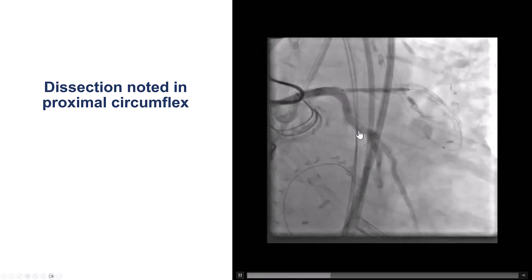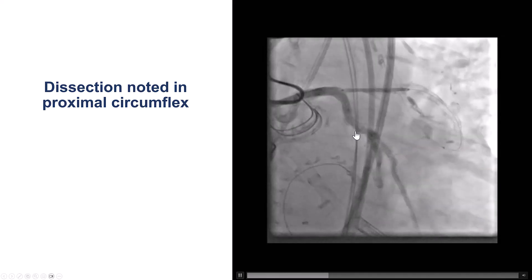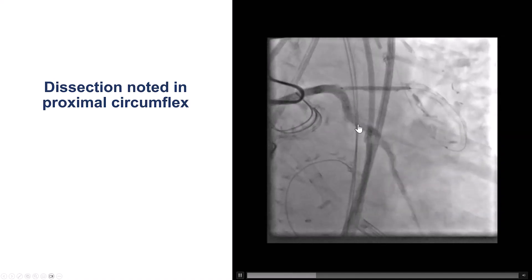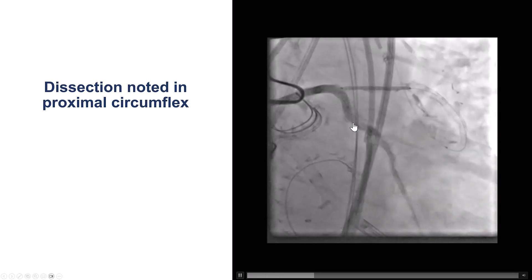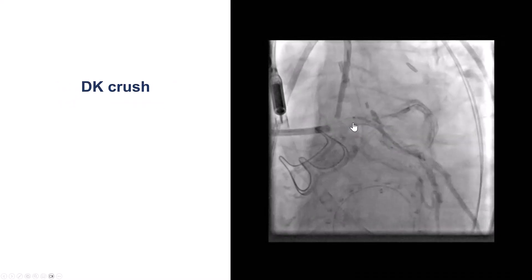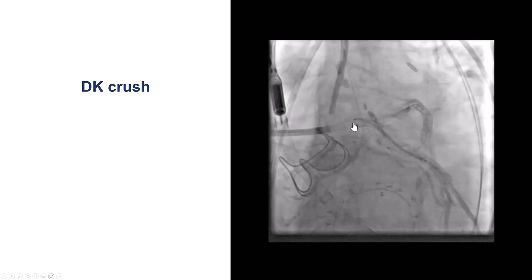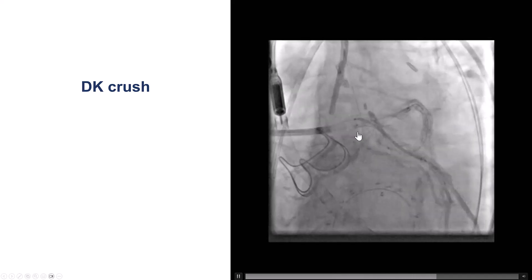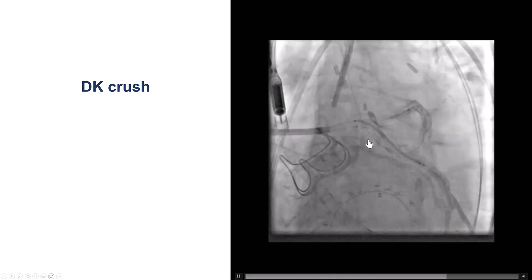Most likely this dissection was the result of using the snare. This is one of the downsides of using snares in native coronary arteries or bypass grafts — they can cause dissection. This changes the dynamics because we need to make sure we have good flow into the circumflex.